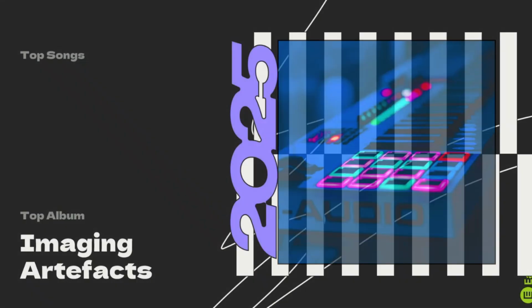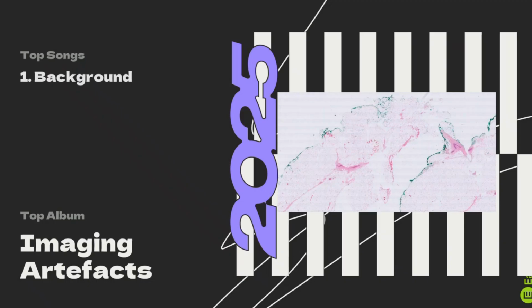When we start considering imaging artifacts, these are a different kettle of fish, really. So 32% of our submissions demonstrated background artifact, like here. So this is just a visual distortion. Actually, you can't really see that. It's obviously a projector that's not used to demonstrate digital images, but what I can see is there's lots of pixels, there's lots of little squares going across in a pattern across the image, and it goes across the tissue as well. So it's like a visual distortion. It's quite distracting to pathologists, and this should be clear. So this can just be fixed by calibrating the scanner or fixing the white balance.